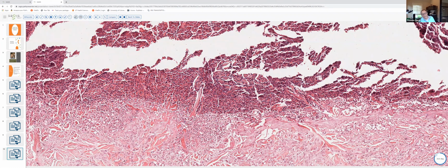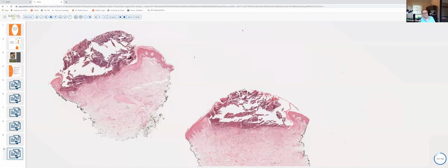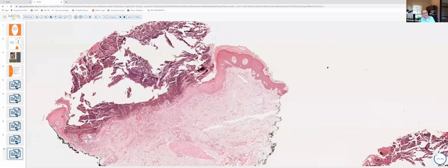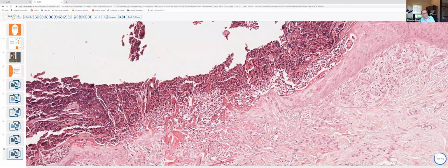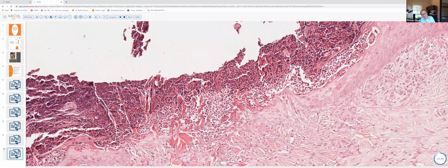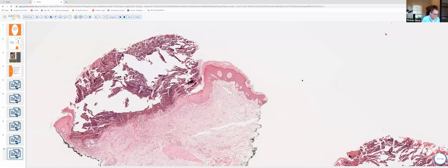These are bigger, they're more variable in size than the elastic fibers, and frequently, because there are a lot of neutrophils present in the setting of RPC, the collagen fibers will start taking on a bluish color. So they're more commonly blue than the red fibers that one sees in elastosis perforans serpiginosa.